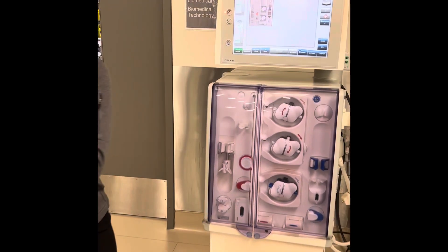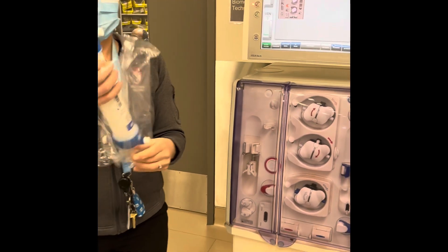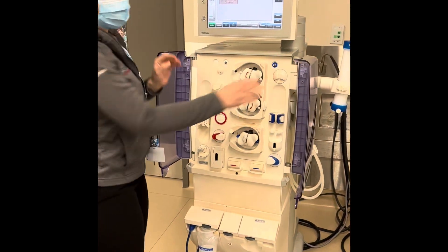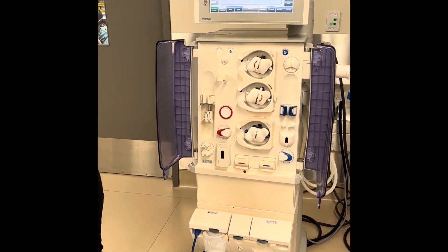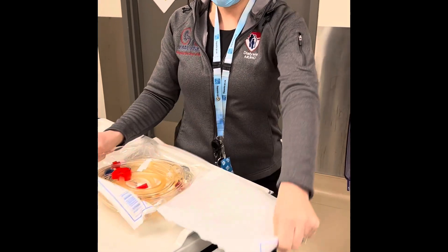The first step I'm going to do is take my dialyzer out and put it on the holder. From there I'm going to open my doors, open the tubing — and just to let you know, there's a little tab on the wrapping so you don't want to fight with the wrapping paper.